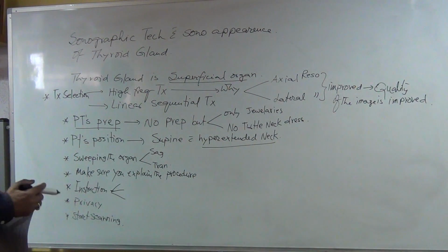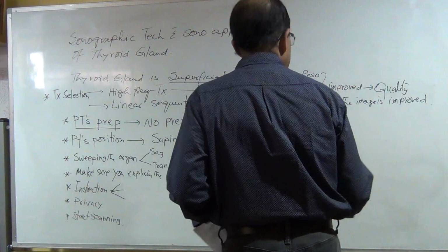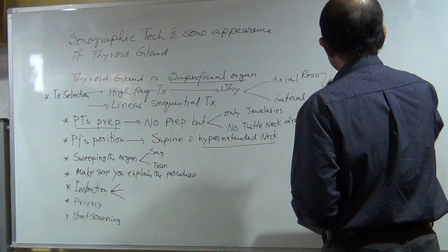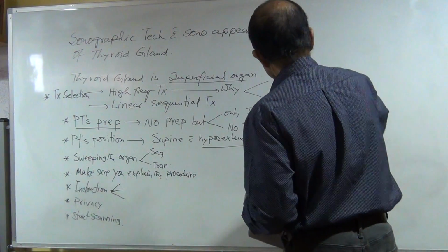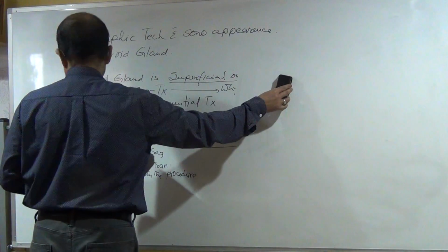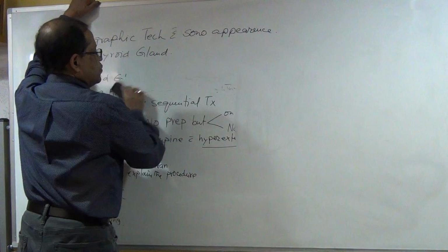So one thing I'm going to teach you, while you will be scanning, how are you going to start? You have to start in transverse view. Both thyroid gland you can see.